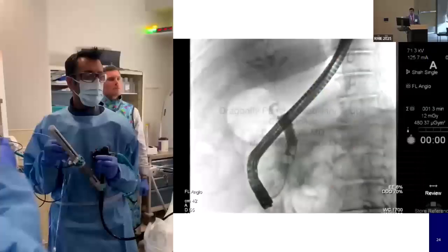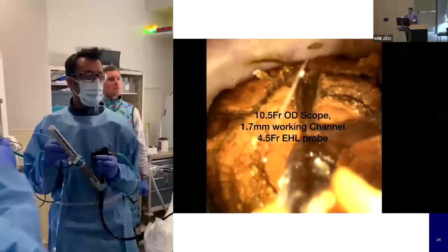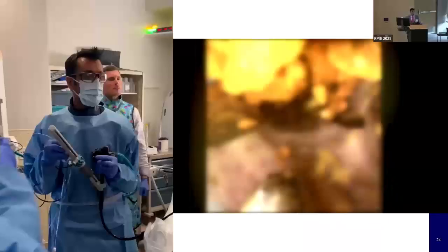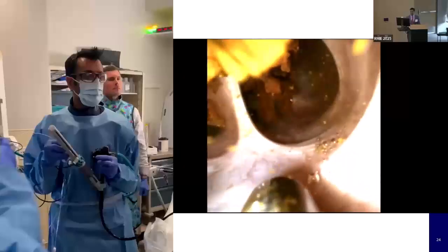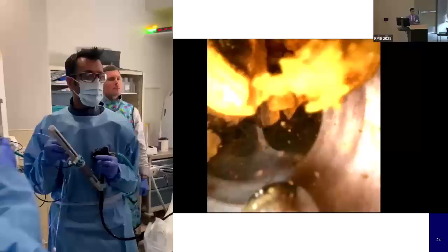This is a homage to Raj Shah. I put this up as kind of a joke at DDW because it's me holding this, but it's Raj Shah's video. And it's the wonderful things that Colorado has brought to all of us. So the magic of this cholangioscope is how big the working channel is, and the optics, and how ergonomically it can be very successful in the future.